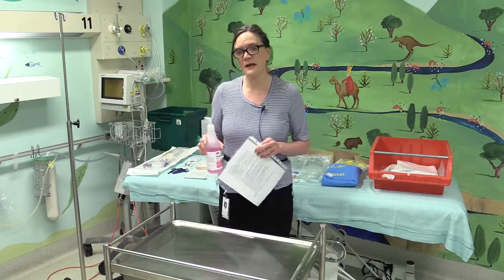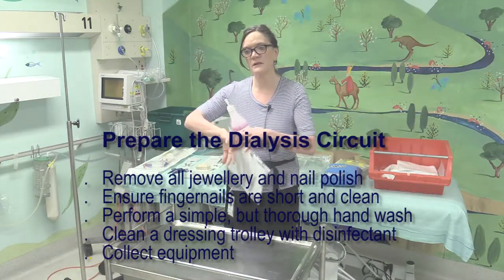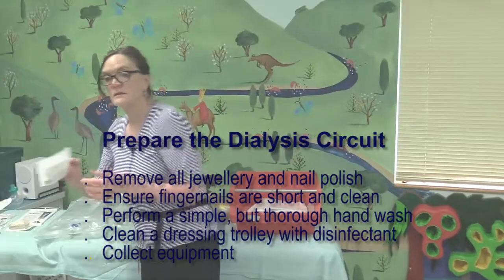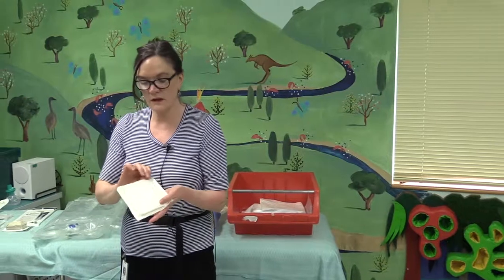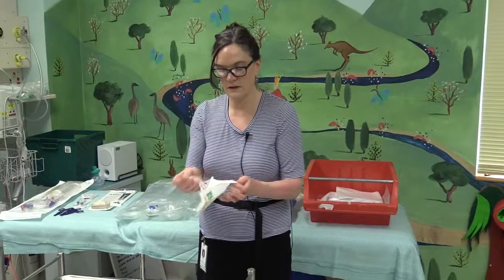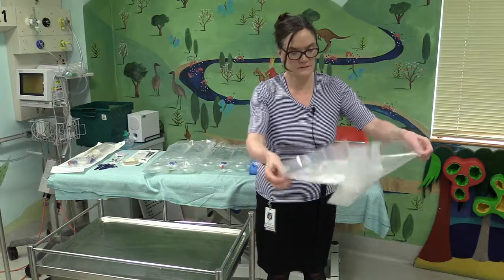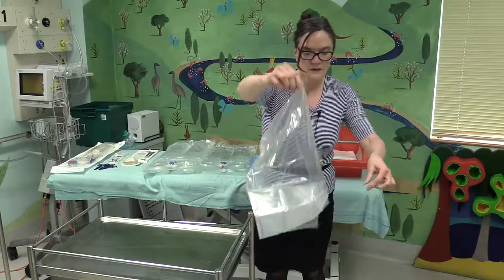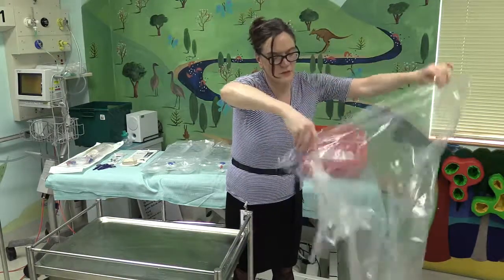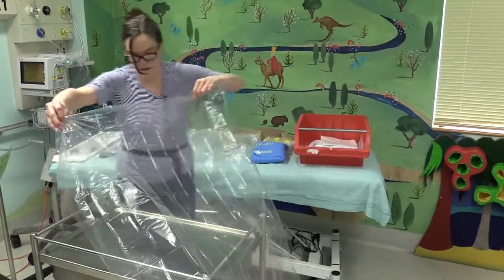I'm going to now wash my hands for 1 minute from fingertips to elbows, and remembering the webs of my fingers, and pay particular attention to the fingernail. Setting up the equipment, I have a sterile drape to cover my trolley. Just touching the corners and holding the drape away from my clothing, and to cover the trolley.